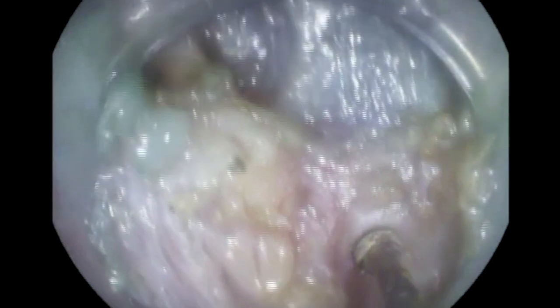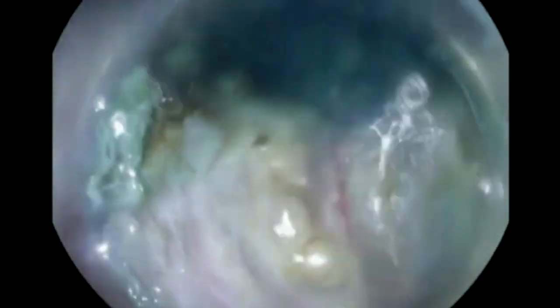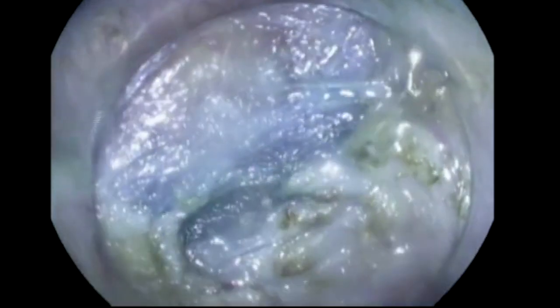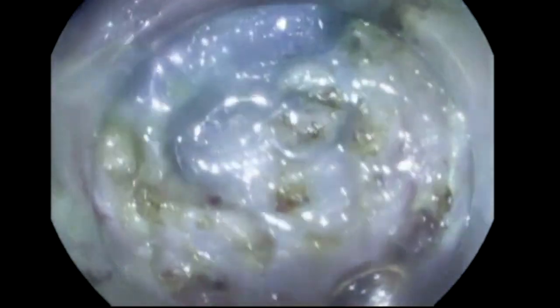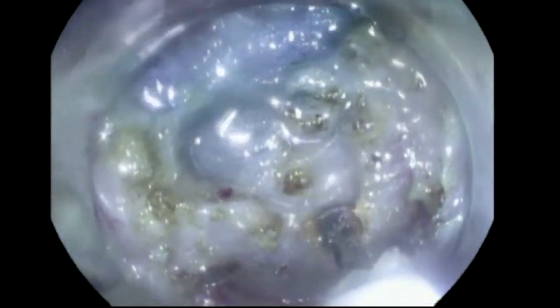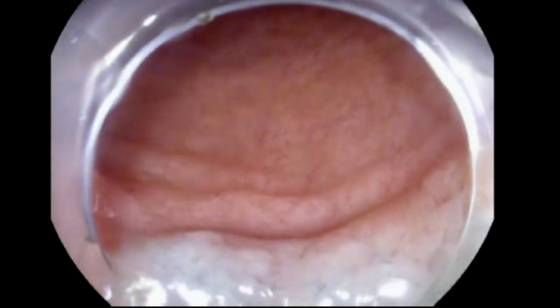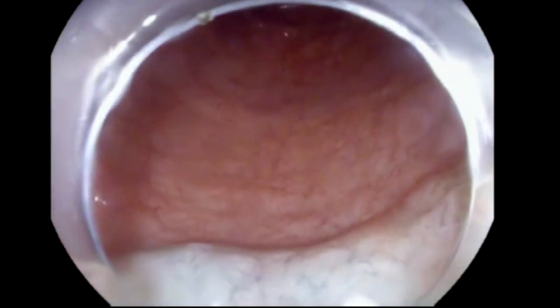I will inject more at times, as you see here, to separate the mucosa from the muscle layer, because in that area we have a very small area of submucosa. Then you gradually cut the muscle. Now we have completely cut the pyloric muscle. On the other side there is the duodenal muscle layer. So we carefully addressed the entire pylorus, and now there may be a small residual pyloric fiber to cut. After completing a 2-centimeter pyloromyotomy, you can see that it is really wide open, and we can see the injected methylene blue within the duodenal lumen.